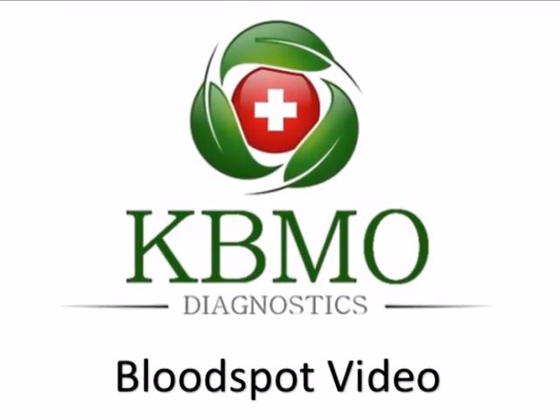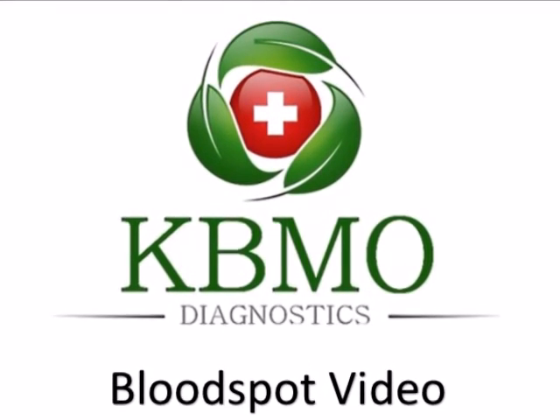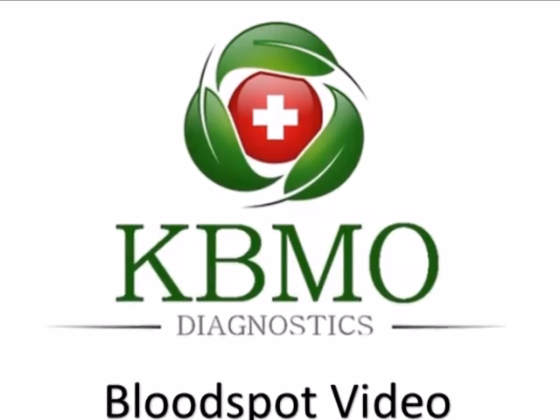In this video we are going to demonstrate the collection of a finger stick blood sample to send to the lab for testing.